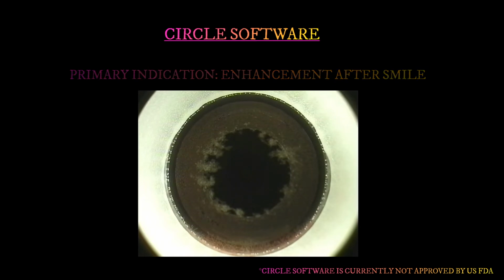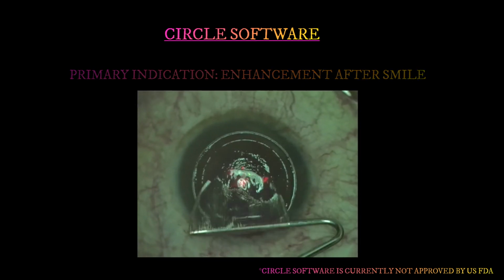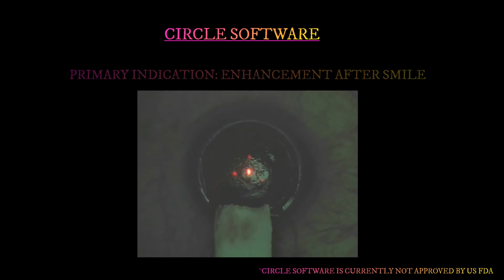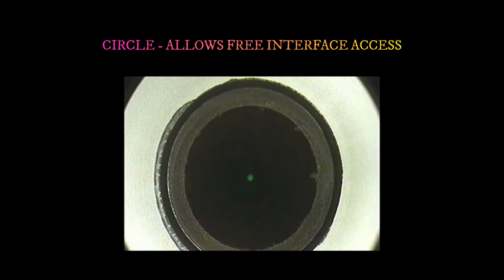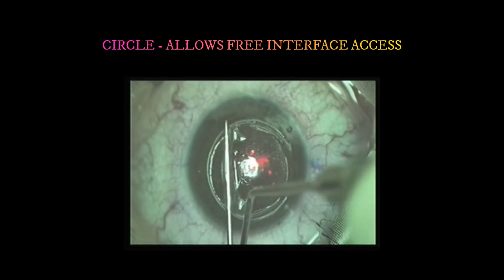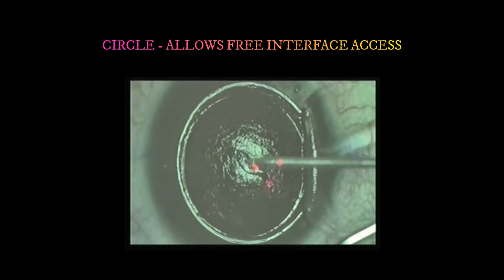Circle software is a special tool primarily indicated for enhancements after SMILE. However, its use in complicated SMILE scenarios is an off-label indication aimed at converting the cap into a flap, thereby allowing free access to the irregular interface.